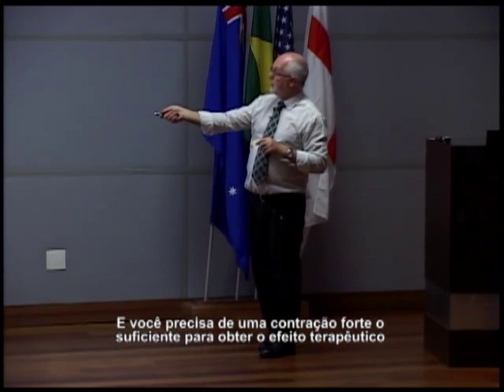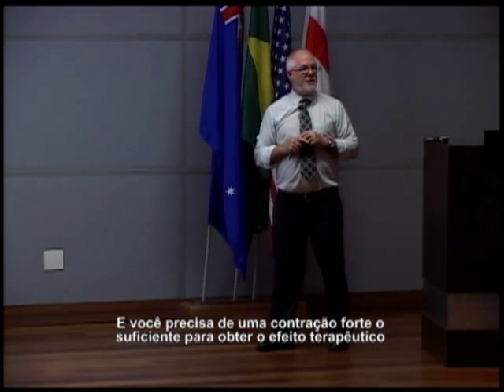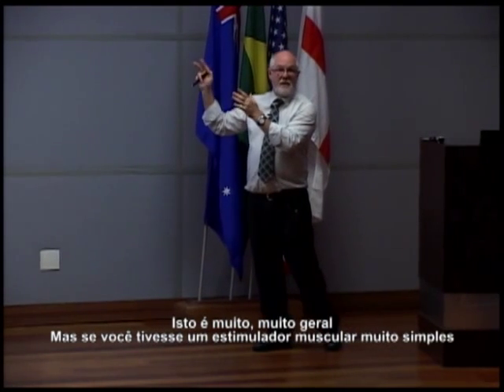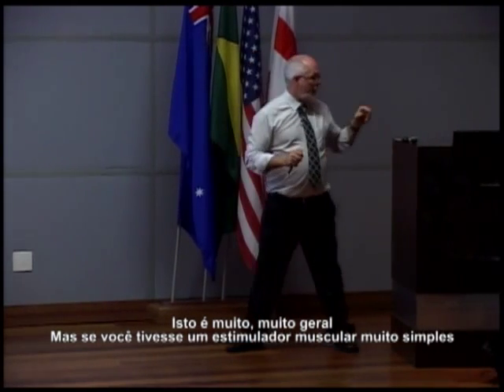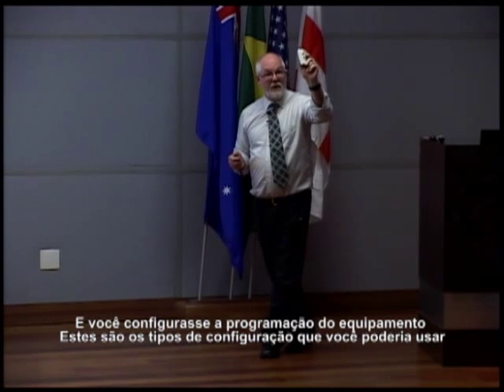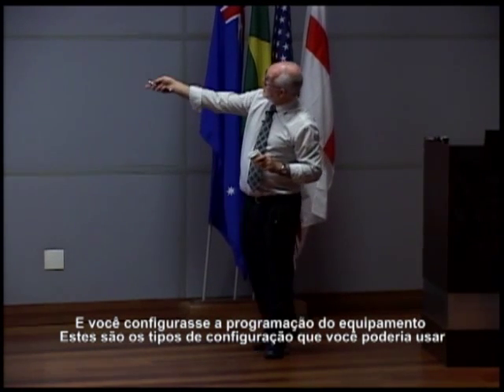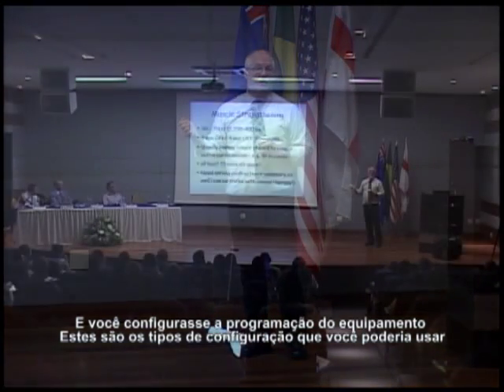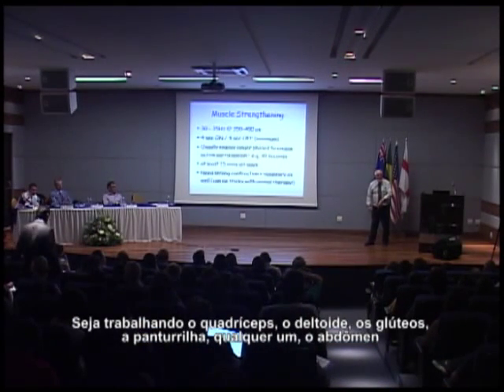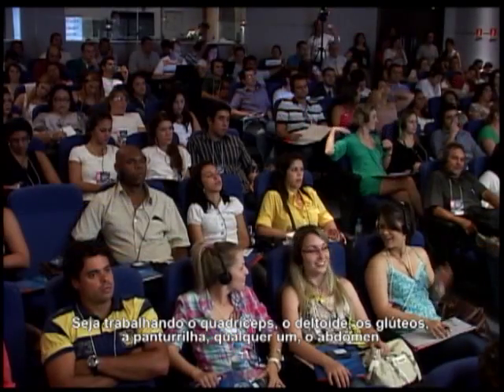And you need a strong enough contraction to get a therapy effect. Now that's very, very general. But if you had a very simple muscle stimulator and you were going to set the machine, that's the kind of settings you could use, whether you're doing the quadriceps or the deltoid or the glutes or the soleus or the abdominals.